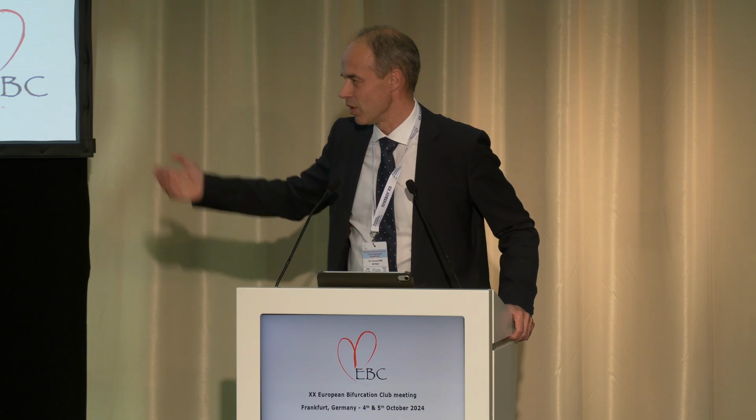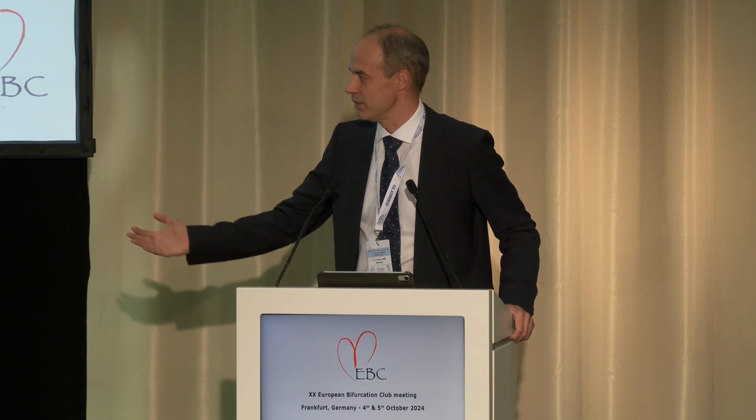Okay. The problem is that it's a small study. It's definitely not powered for outcome data. The follow-up data or the clinical follow-up of the patients was only meant in terms of safety. Of course, if we would have had a signal towards stent thrombosis or restenosis, that would have been important to report.